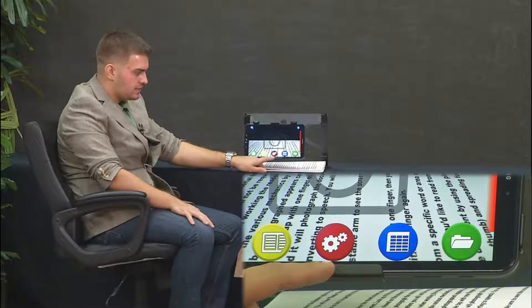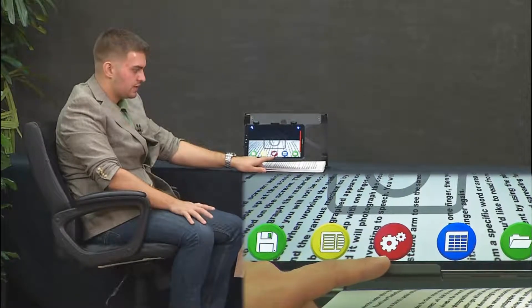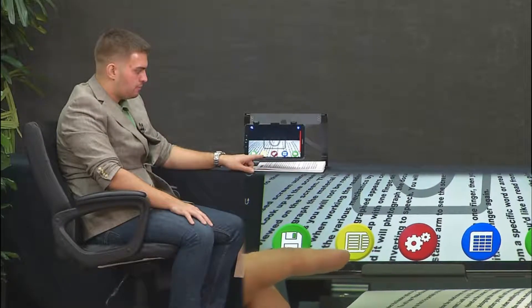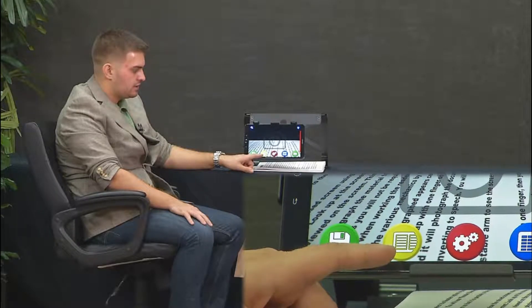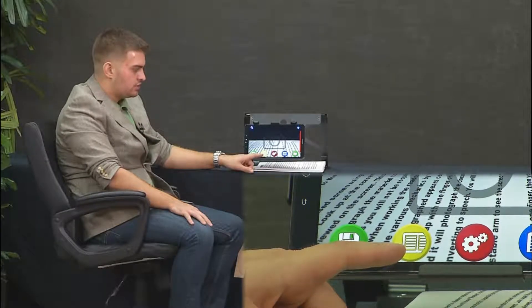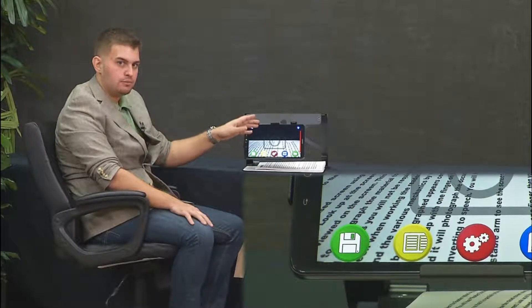The bottom middle icon is the settings, where you can change the language, volume, rate, and voice. The yellow button, second to last on the left side, toggles between original mode and wrapped mode. Original mode is what we were looking at — a frozen image that you can navigate around with one finger.